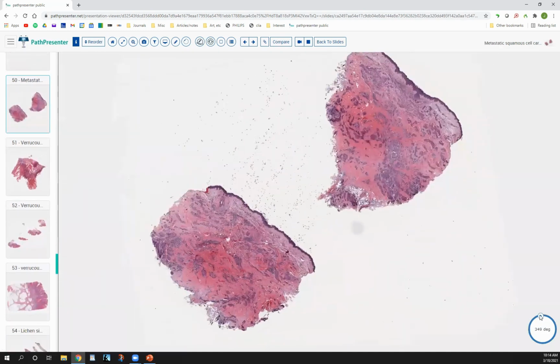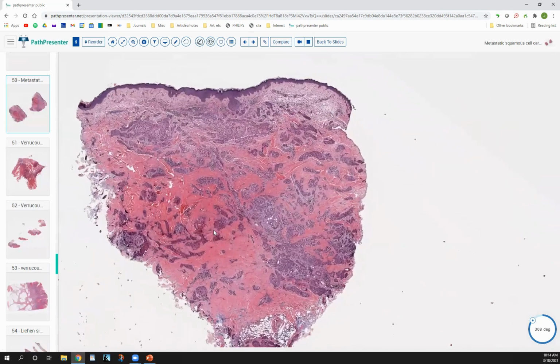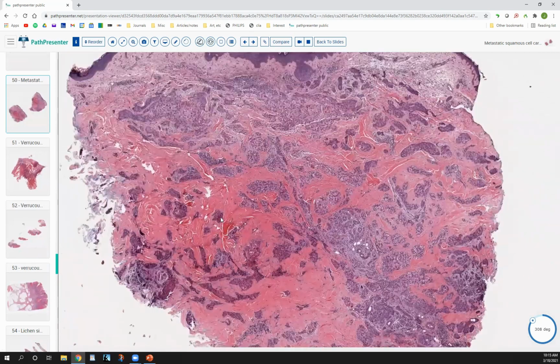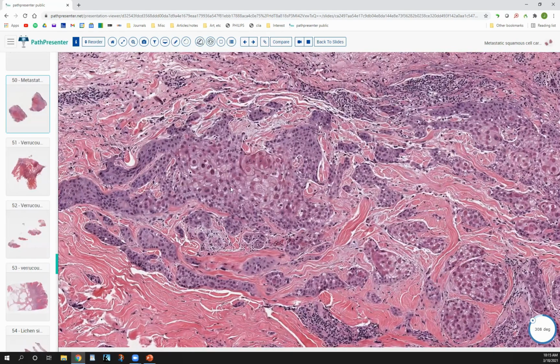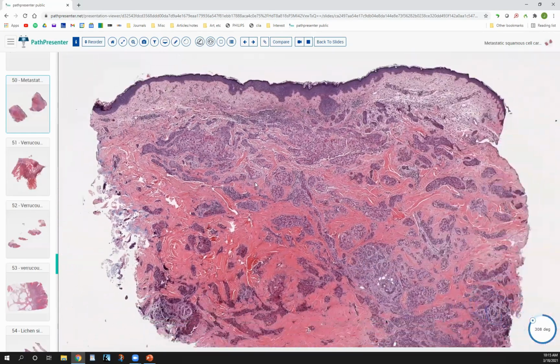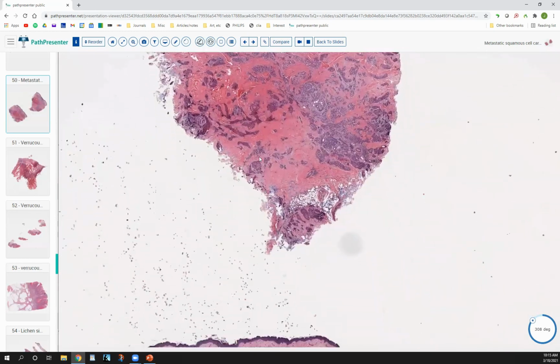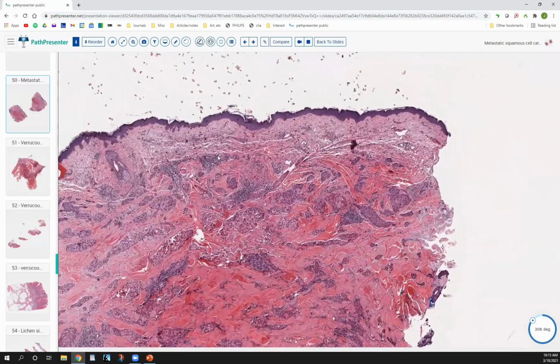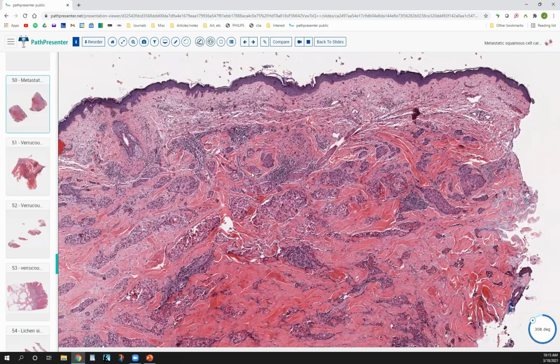And then you have the thing that sometimes causes us trouble here. You have what you can clearly identify as an ugly invasive squamous cell carcinoma. No problem right here. You have this nice focal keratinization, easy to recognize as ugly keratinocytes, really jagged islands infiltrating with a desmoplastic response. So no problem recognizing this as poorly or maybe moderately differentiated squamous cell carcinoma. The problem is you don't really have connection to the epidermis. So then you have to think, well, could this possibly be a metastatic process? And in this case, it is. This is an example of metastatic squamous cell carcinoma.